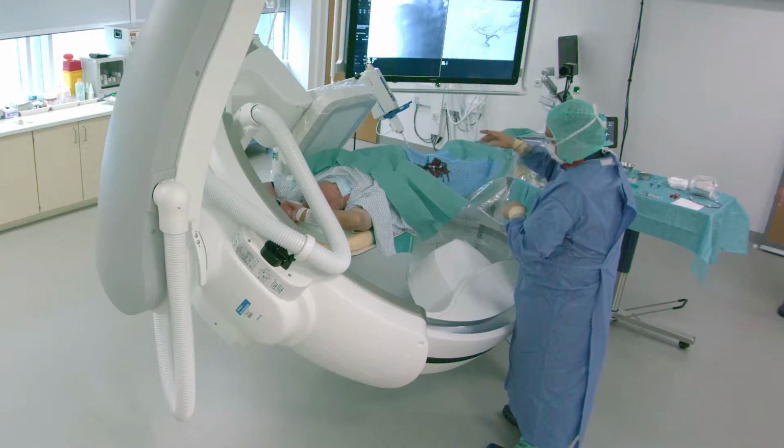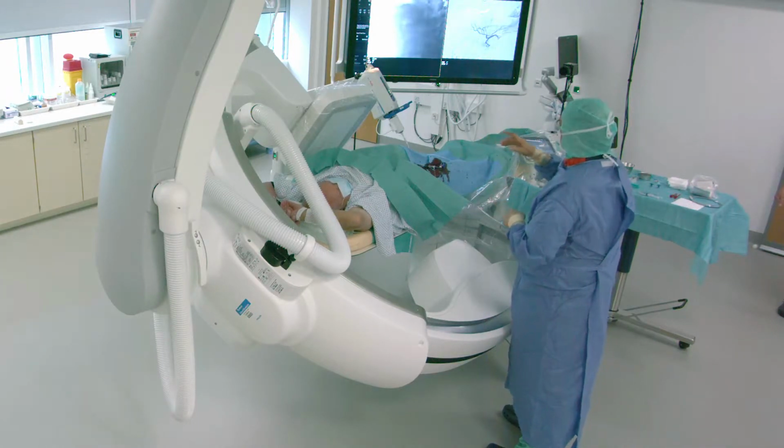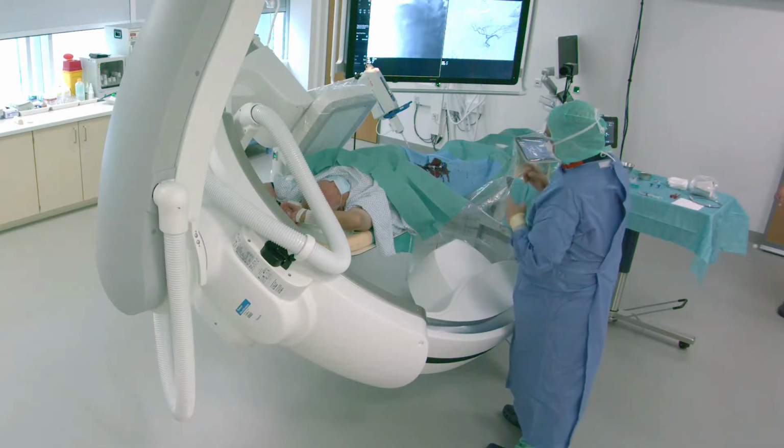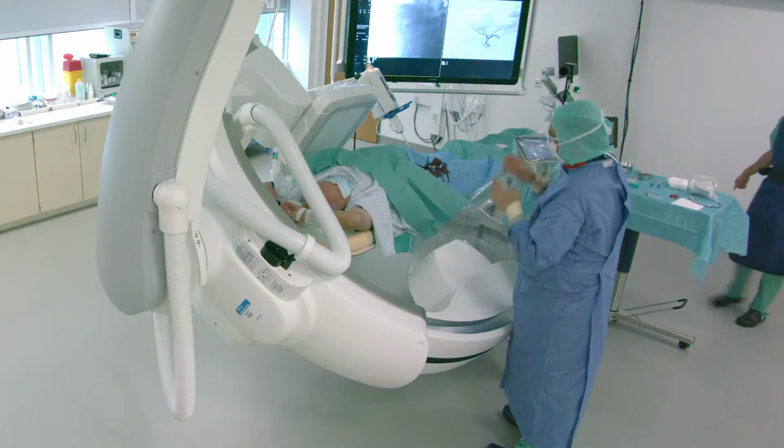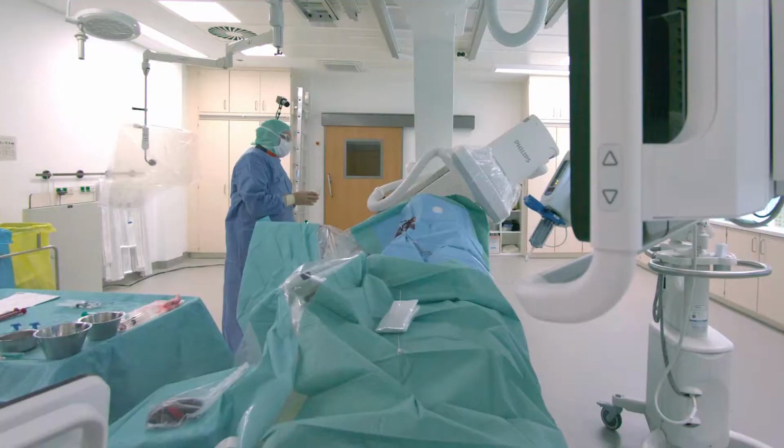The patient will receive breathing instructions and an explanation on how the Expert CT scan is performed. Since this will be a dual Expert CT scan, there's an interval time between the two Expert CT scans. This can be used for the patient to breathe in between. Press the acquisition button in the control room.